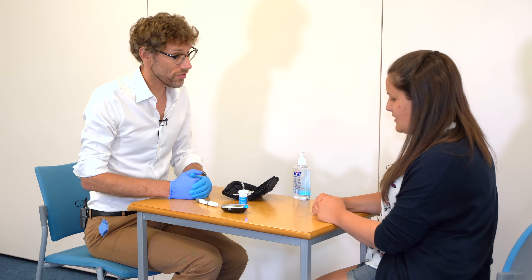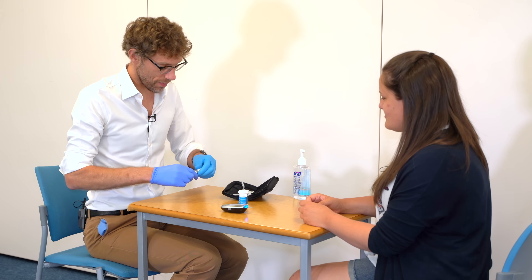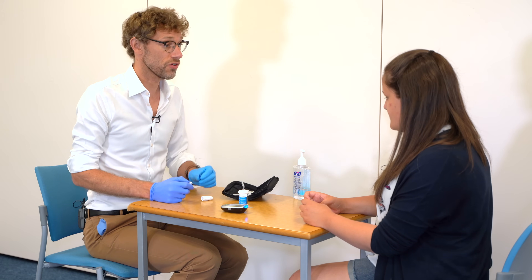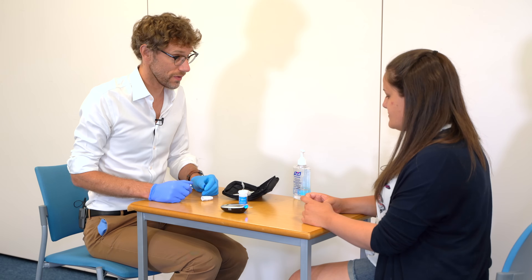Do you have any other questions for me at the moment? No. So just to finally wrap up — when you've finished with the pen, you're going to take it apart and take the sharp and make sure you put that into the sharps bin, and we'll make sure we get one prescribed for you. Any other questions? No. Well, have a good day and thank you for popping in.